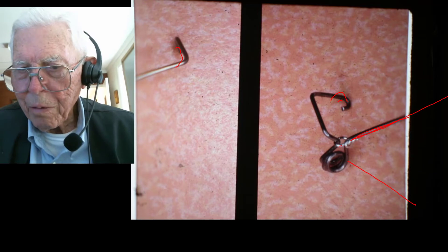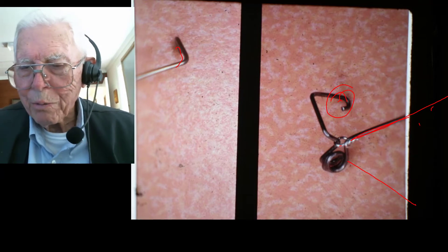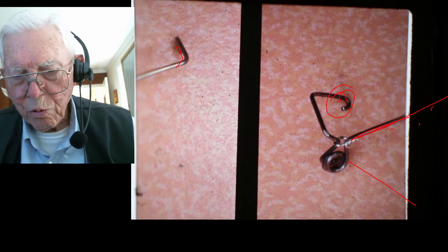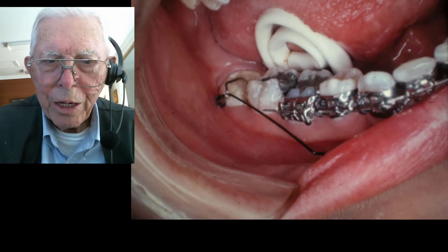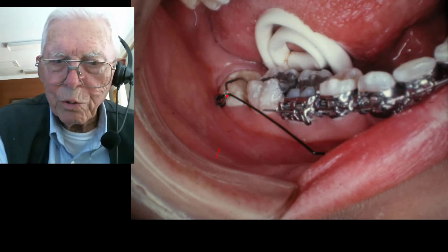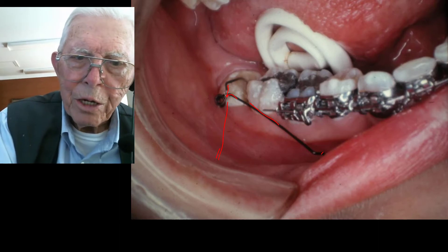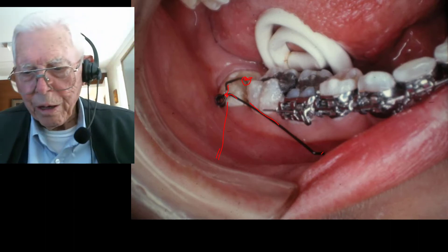After it got hardened real good, I cut this wire. I laid it in between the bracket and the tooth over here, and cutting that put a lot of activation on this. Now I stick it on the tooth and the wire is still tied on there. So if I cut that wire, this would go down this way and stick in the cheek. I put as much activation as I could bond it on with, stuck it over here, and embedded that in the acrylic. I let it get good and hard before I did anything.